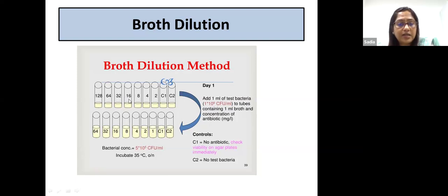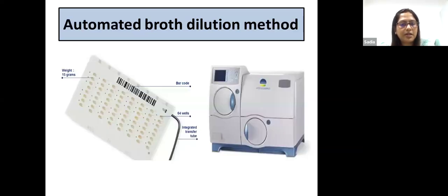Okay. So now this entire process is kind of complicated. We can see from this also the challenges of using so many tubes for one antibiotic. It becomes very, very distressing, and it's very cumbersome for a routine laboratory to do these methods. Right. So generally, MICs were reserved for certain antibiotic testing, but now with the advent of the automated broth dilution method, every lab has been able to practice this easily.